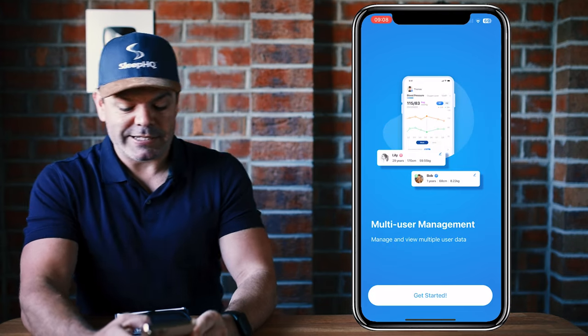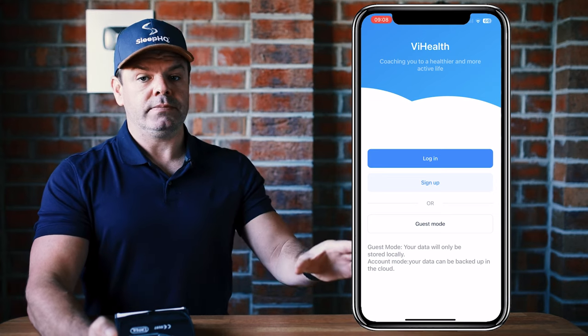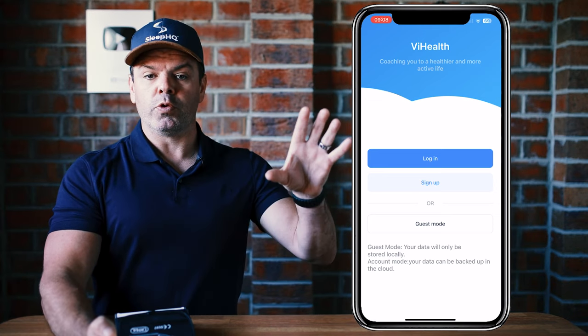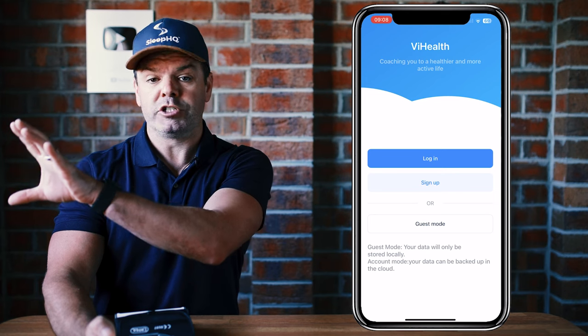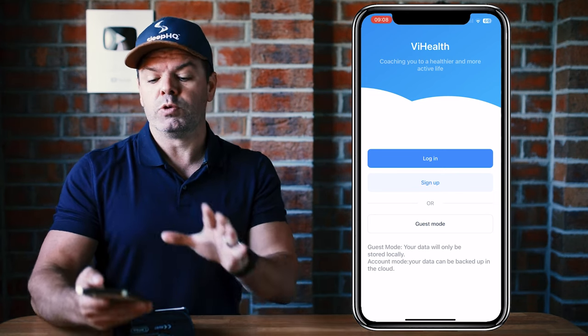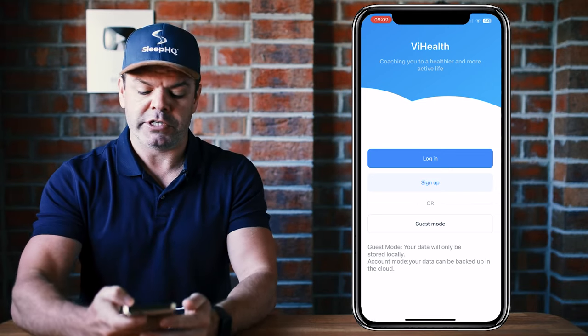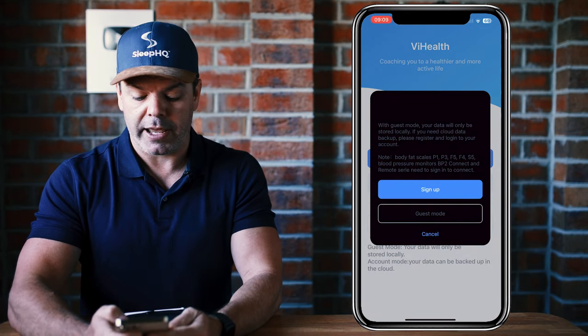Here we are — get started. You can create an account, which will send all your data to the ViHealth service over in China, just so you know. Or you can choose guest mode, which stores all the data locally on your device. Today we'll just use guest mode — it's up to you whether or not you want to create an account.